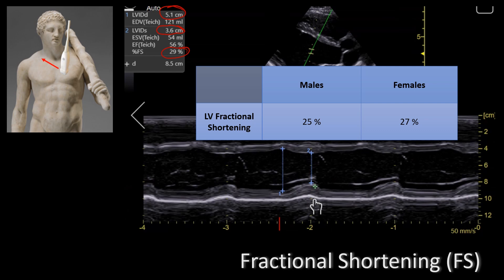Also note that this machine also calculates the ejection fraction by using the Teichholz method. The Teichholz method uses the internal diameter to calculate volume. However, the Teichholz method is not the best way to calculate ejection fraction since it makes a lot of geometric assumptions about the left ventricle, and the only variable you're actually putting into the equation is the diameter, so there's a lot of sources of error if you're using it simply to calculate ejection fraction.